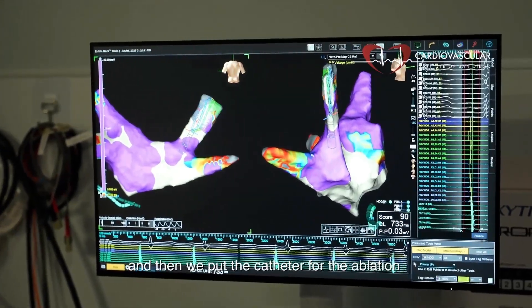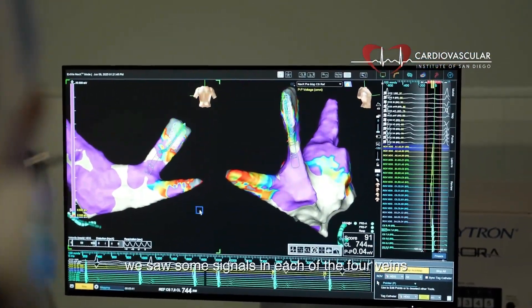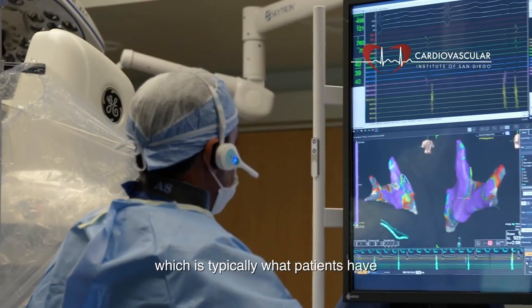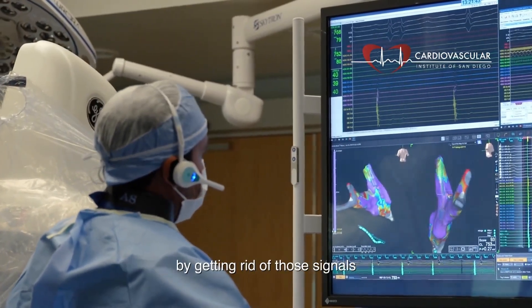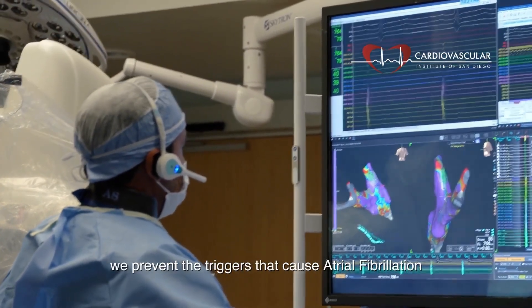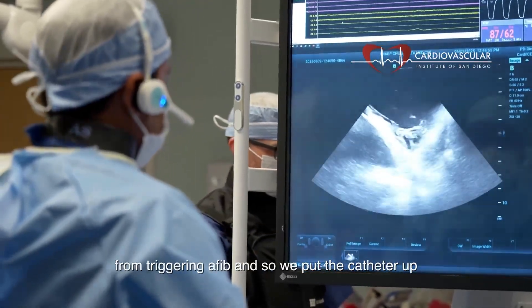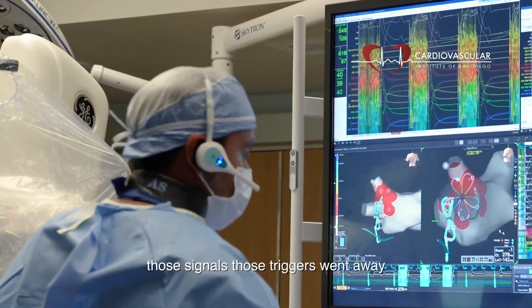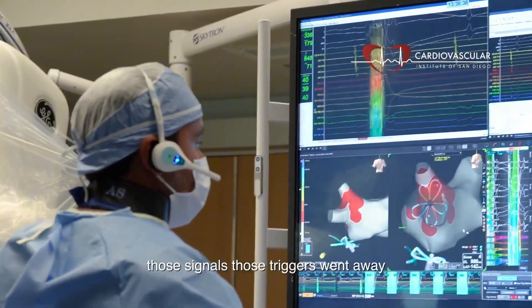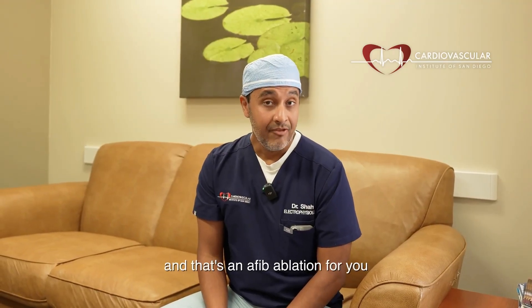We put the catheter for the ablation up into the heart and saw signals in each of the four veins, which is typically what patients have — and those signals are what we're trying to get rid of. By getting rid of those signals, we prevent the triggers that cause atrial fibrillation. We applied our energy, and as you saw in the video, those triggers went away. Pretty simple and very safe — and that's an AFib ablation.